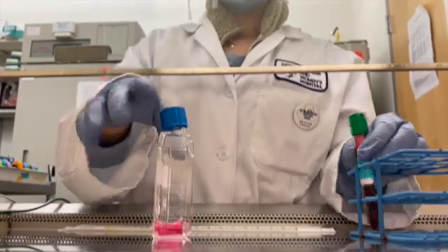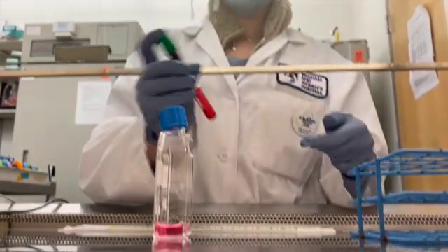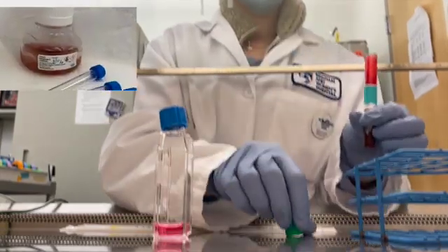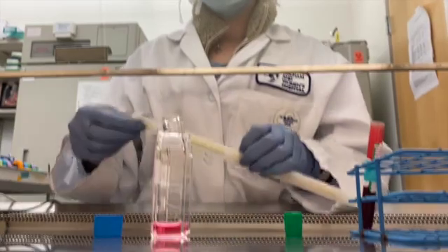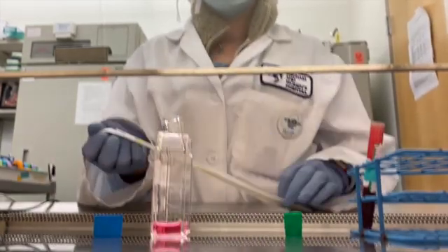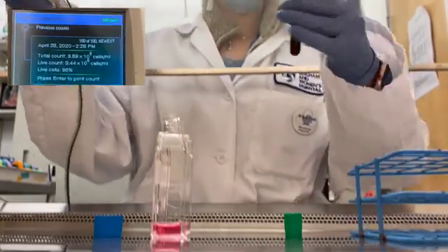Once you've added your media to the flask, it's time to aliquot your sample. The first step is to mix up your sample and check for any clotting. Clotted samples are treated with collagenase, a liquid enzyme that helps to dissociate cells from a clot and prevent further clotting during the incubation. The volume of sample that you will aliquot is adjusted based on the live white blood cell count you got from your automated cell counter.